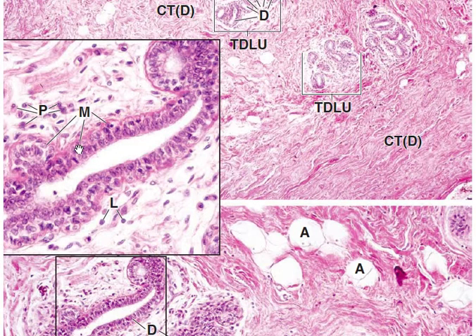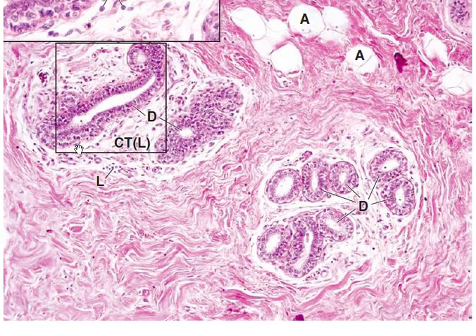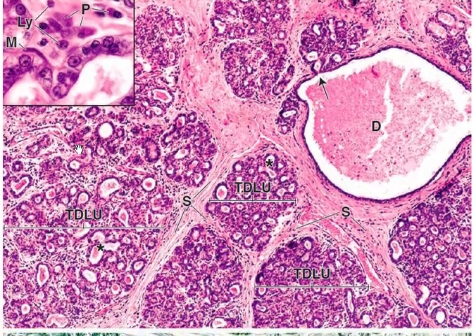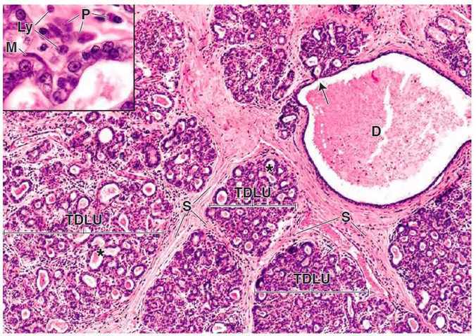All right, so that was inactive breast tissue. Now let's talk about the mammary gland during the late proliferative and lactating stages. Wow, that looks so much different.